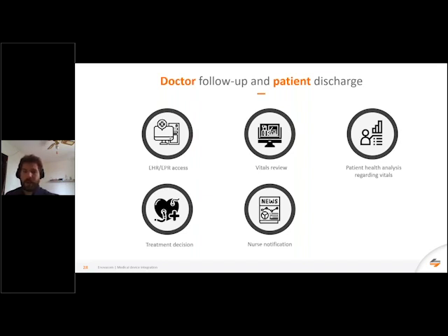So the doctor reviews vitals inside the EHR and decides whether to adapt the treatment or discharge the patient. If Sarah reports vitals late, the decision can be delayed. Maybe the patient's health can deteriorate, because of the time gap between device consulting and vitals reporting. The treatment is not well adjusted, and it can postpone the patient leaving. If the vitals are not present as expected on the EHR, the doctor has no idea of the patient condition and could decide to gather information directly on the spot, losing valuable time in a busy day.